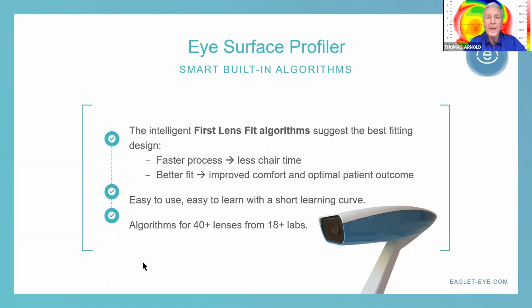Both the instrument and the software is very easy to use. My technicians took to it very, very quickly. And again, like we said, there's over 40 algorithms already built in from 18 different labs, and we're adding more every day.